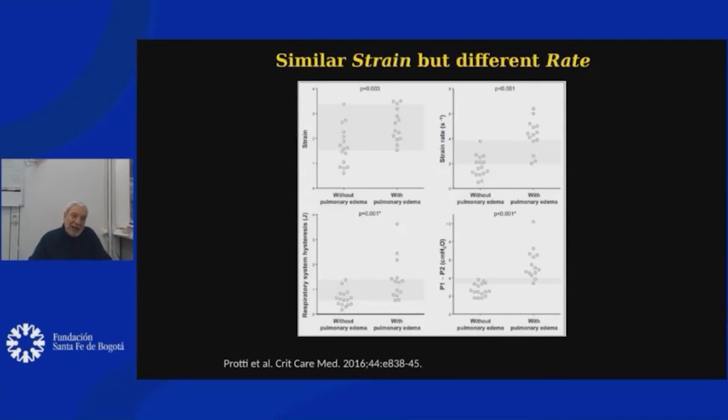So in one case, the strain was provided very rapidly. In the other case, it was more smoothly. And of course, if I have a strain very rapidly, the amount of energy is concentrated in a shorter time. And this was causing some problems compared to the smoother increase of energy.